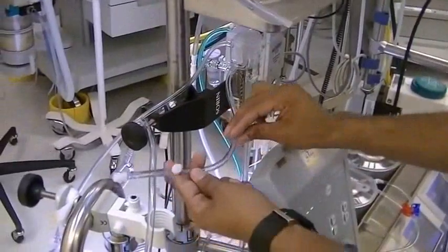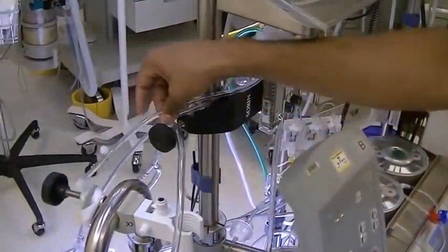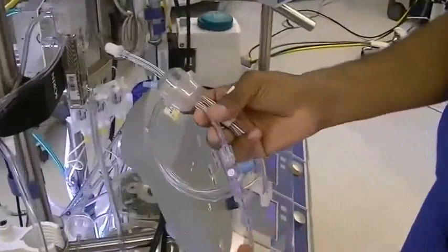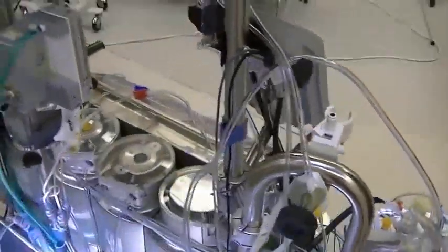Next, make sure first of all that the cardioplegia delivery line is going around the holder there instead of going through. Also, now is a good time to hook up the pressure dome for the cardioplegia, as well as the pressure relief line.